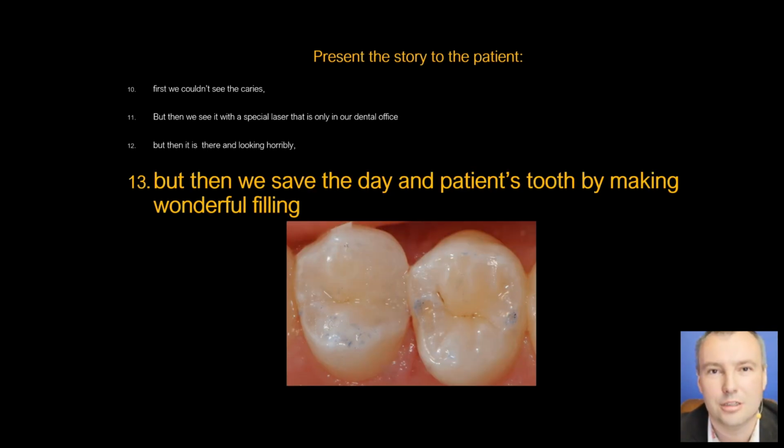We clean it. You never take a picture of a cleaned cavity. Patients believe that cavities that are cleaned with the drill are white, which is not true. But let them believe it. Don't take only the picture of the filling after you make it. The best way is before checking the occlusion, because then the filling is the most beautiful. So look how wonderful it looks.